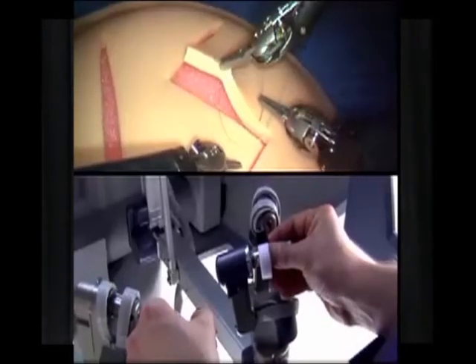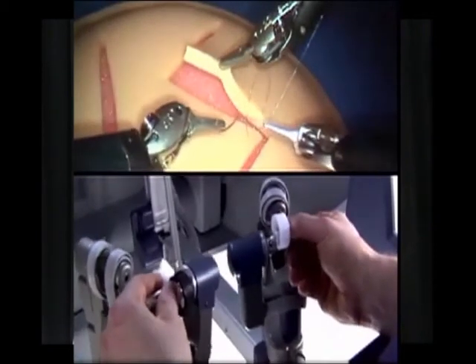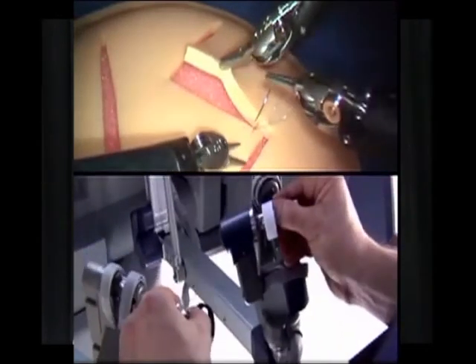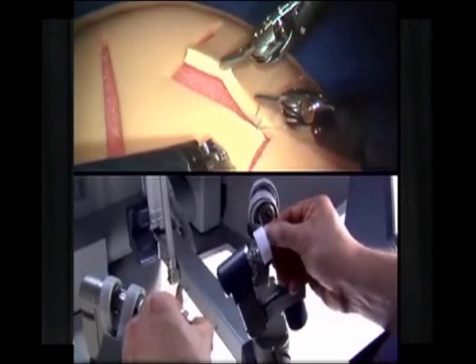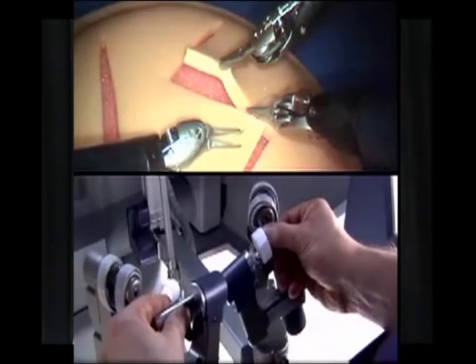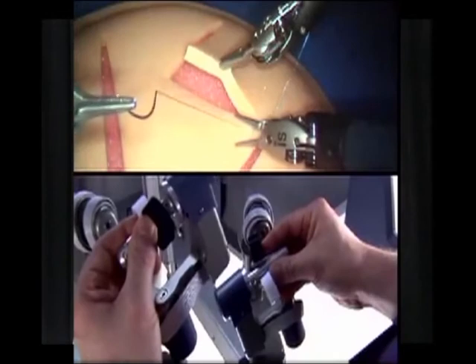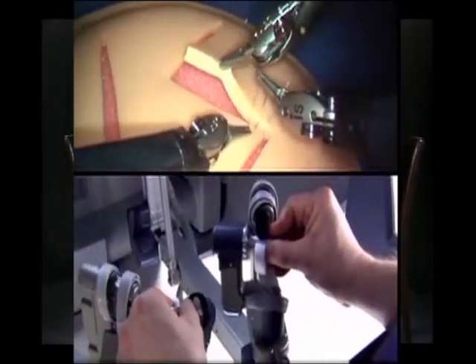There's this surgeon console, which is kept a little distance away from the table, and the surgeon is sitting behind the console. Now when he moves his fingers here, that is translated into the body of the robot, which moves the instruments robotically, mechanically. So if you want the instrument to move 5 degrees, you can do that by manipulating the fingers. So all that movement then translates into the inside of the patient.